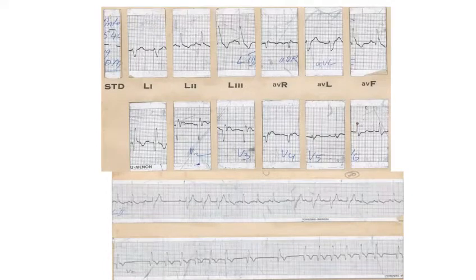And what is the explanation for this right axis deviation? Axis about 105, 110. Whether left posterior hemiblock is present? Yeah, in the setting of anterior myocardial infarction, RBBB, and then there is a right axis deviation, I think it's correct to conclude that the patient may be having a left posterior hemiblock also. Okay, right. Yes, very good. Left posterior hemiblock. Yes, sir.